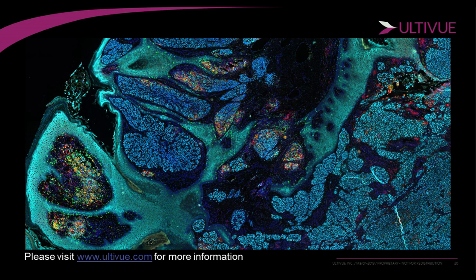any type of relatively run-of-the-mill whole slide scanner that can look at about 5 different colors, so that can visualize a DAPI, a FITC, a TRITC, a Cy5, and a Cy7. Cy7 may be something a little bit more specific to a handful of whole slide scanners that are out there, but that's really it. You don't need anything that has any sort of spectral unmixing capabilities or anything like that.